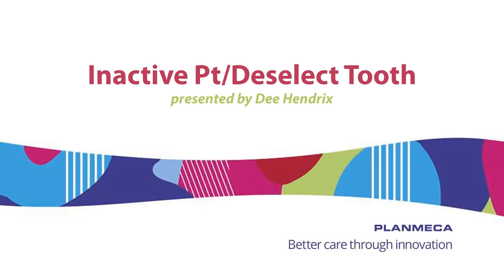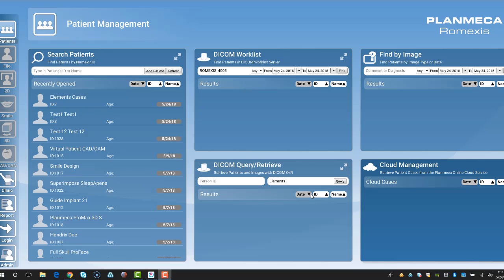Hi everyone, D. Hendricks here, Clinical Specialist with PlanMECA USA, and I'd like to show you how to inactivate a patient and also how to deselect a tooth if you choose the wrong tooth.